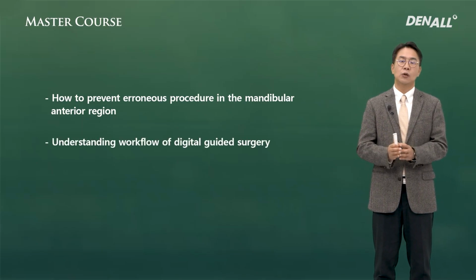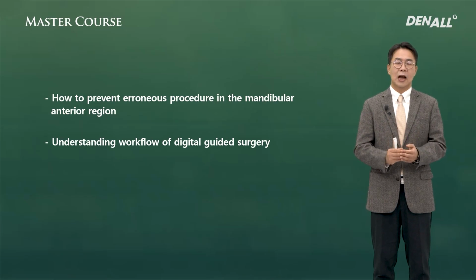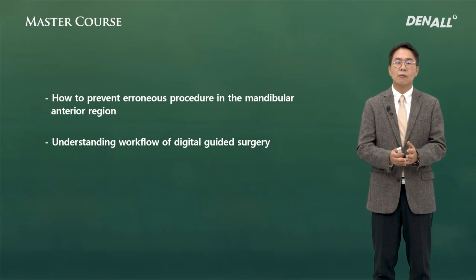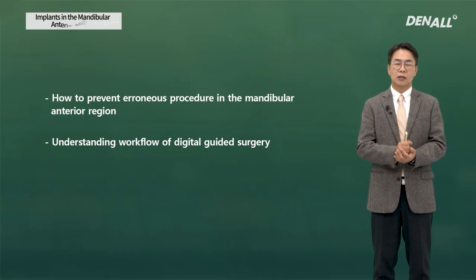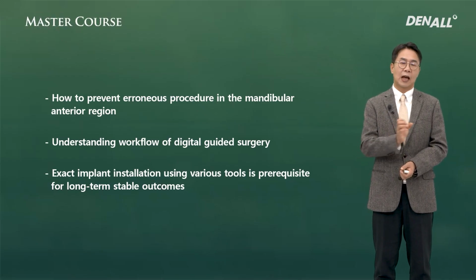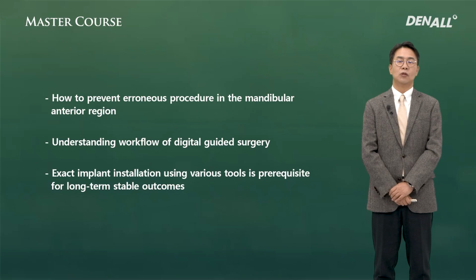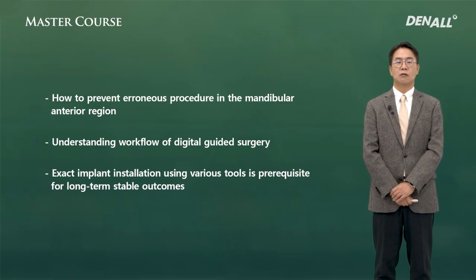For guided surgery, you need to follow the workflow. You need to understand the workflow to determine whether the procedure is for you or not. If you determine that it is for you, you can apply it. If not, you need to get skilled in getting accurate positioning. The most important thing for mandibular or maxillary anterior is the accurate drilling. So various instruments, tools need to be utilized for long-term implant stability, and I hope you can utilize them.